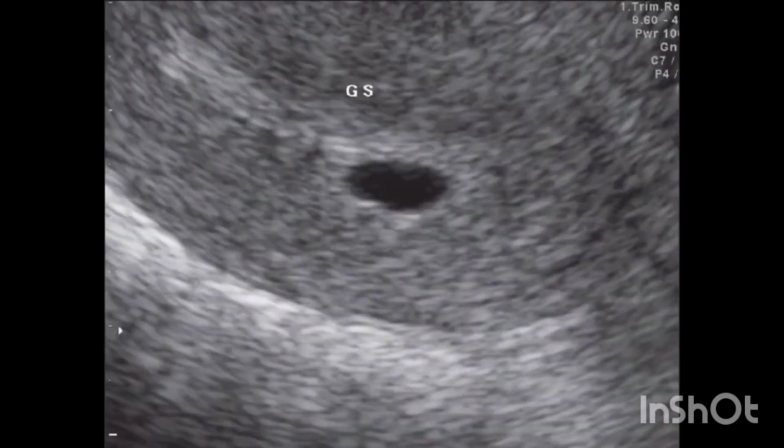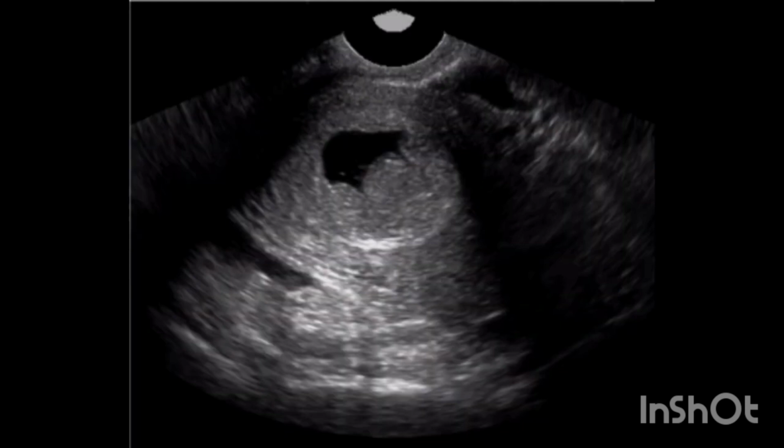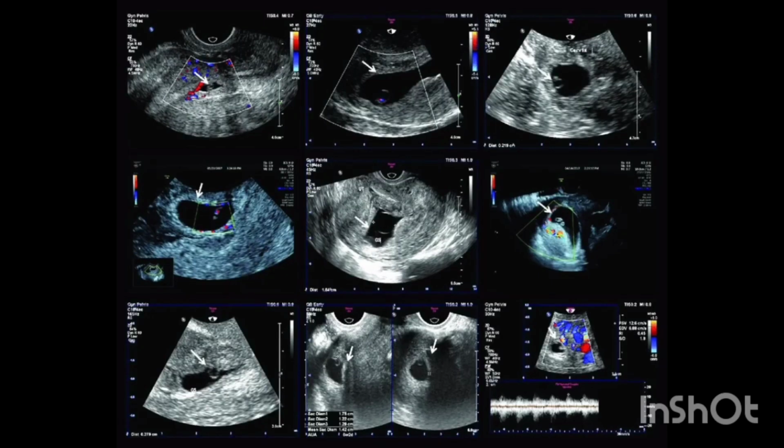The gestational sac should normally be round or oval. An irregular gestational sac with angulations or teardrop shape is associated with a poor prognosis. The advent of ultrasound has allowed a more direct means of assessing fetal structures and development. Measurements of a wide variety of parameters have been devised to establish gestational age. Ultrasound assessment of gestational age is feasible in a majority of pregnancies and may be used to establish gestational age with greater accuracy than physical examination.